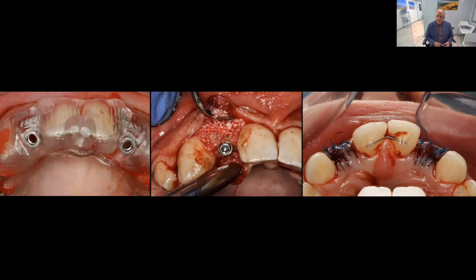So here's Samantha at surgery, and a full thickness flap. I'm going to place those implants fully guided. And I know that I need to bulk out that buccal bone. So in this case, again, because I want that bone to hang around a little bit longer, I'm going to place a xenograft material. Place that xenograft, and I placed a little bit of a collagen membrane over and closed everything up. And in this situation, I'm not going to use healing abutments. I'm going to use cover screws because I want to make sure that that tissue really has plenty of time to mature and keratinize over time.